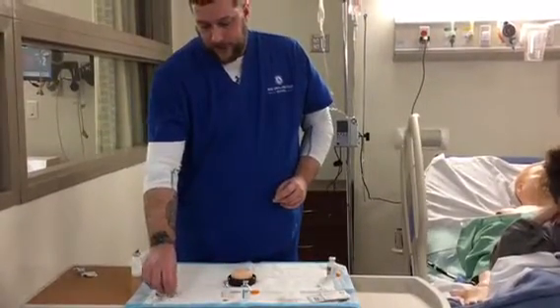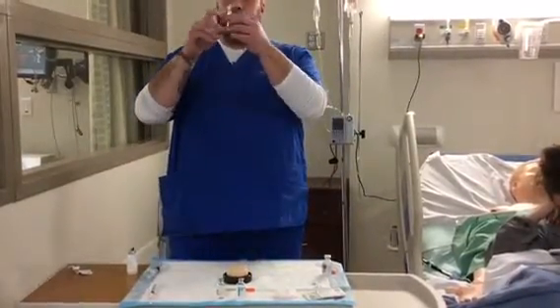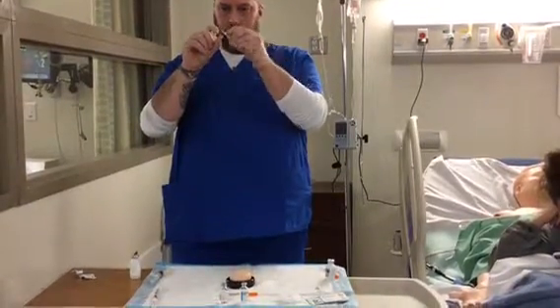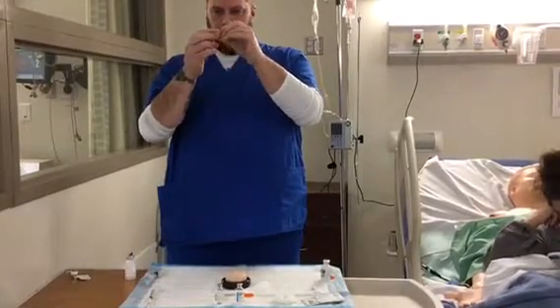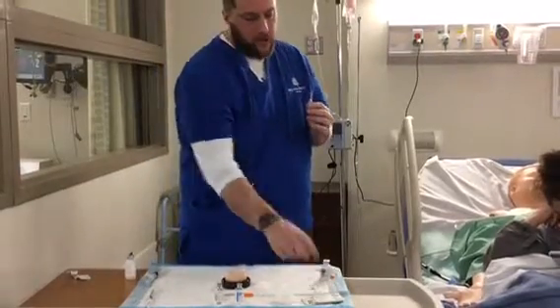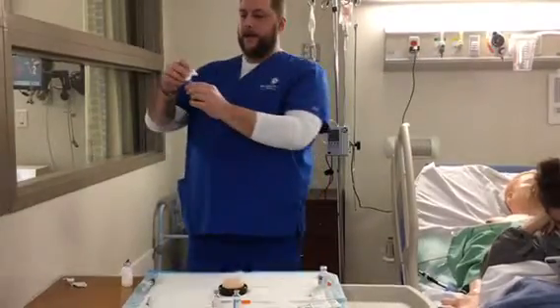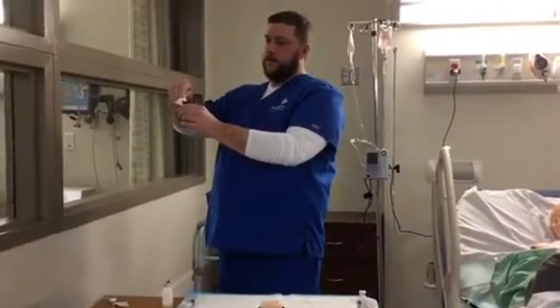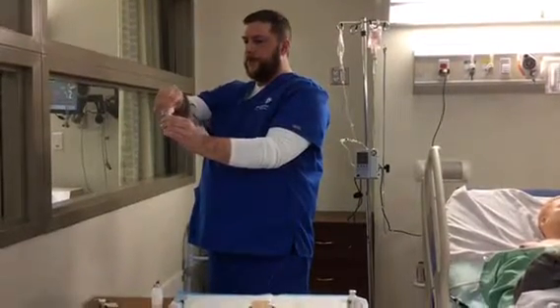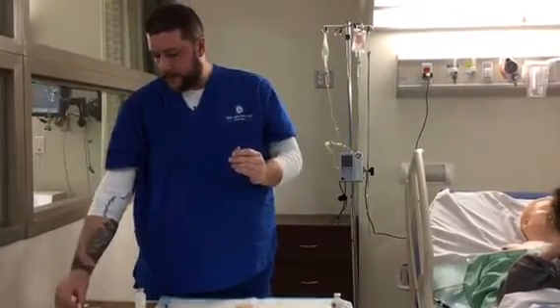And next we have the ampule. With this one here, we take the ampule first. You want to make sure that the medication is out. You can move it, and once it is completely out, you're good to go. Using an alcohol swab, I'll wipe around the edge, and using a gauze, going against me, as to be careful not to break glass towards the face. I'm going to pull away from me and pop it. That would be discarded in the sharps container.